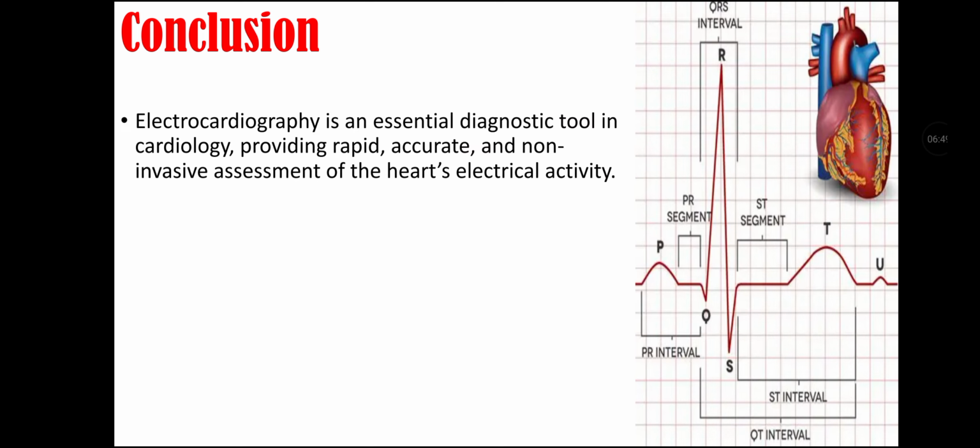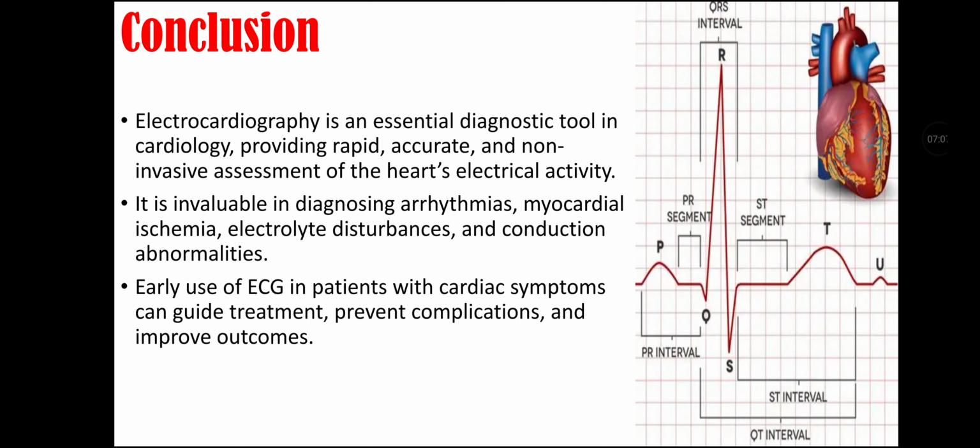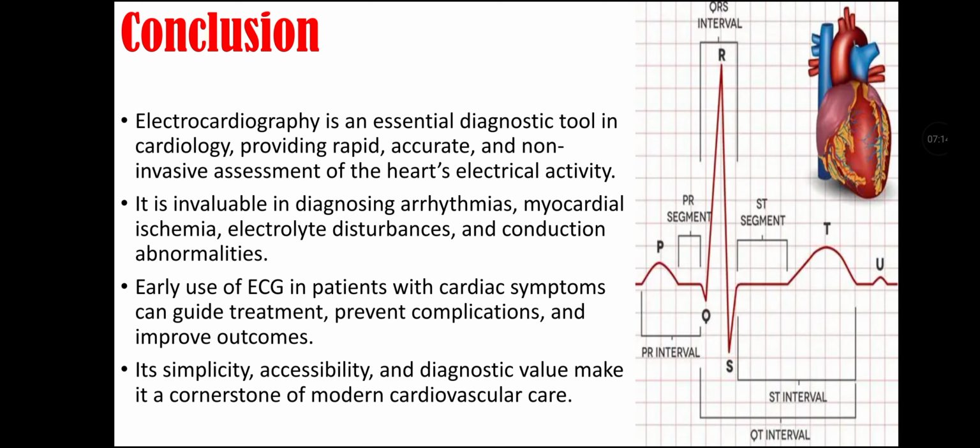Conclusion of this lecture video. Electrocardiography is an essential diagnostic tool in cardiology that provides rapid, accurate, and non-invasive assessment of the heart's electrical activity. It is invaluable in diagnosing arrhythmias, myocardial ischemia, electrolyte disturbances, and conduction abnormalities. Early use of ECG in patients with cardiac symptoms can guide treatment, prevent complications, and improve outcome. Its simplicity, accessibility, and diagnostic value make it a cornerstone of modern cardiovascular care.